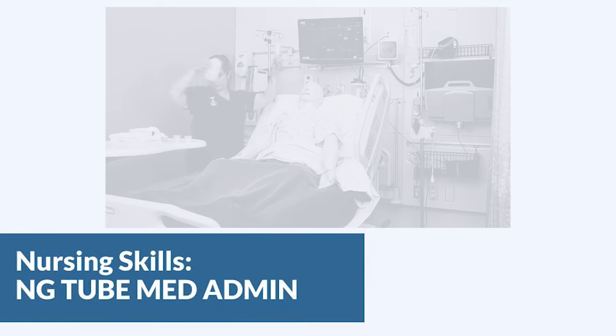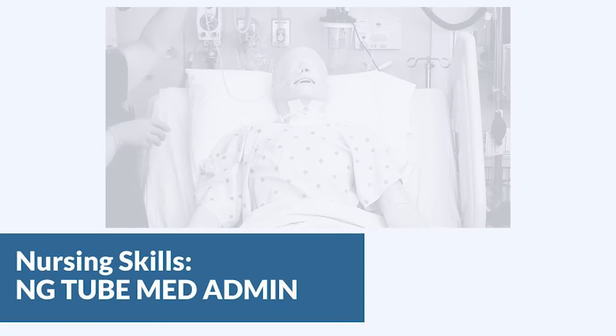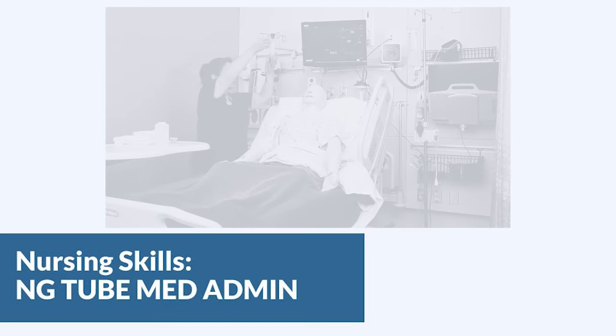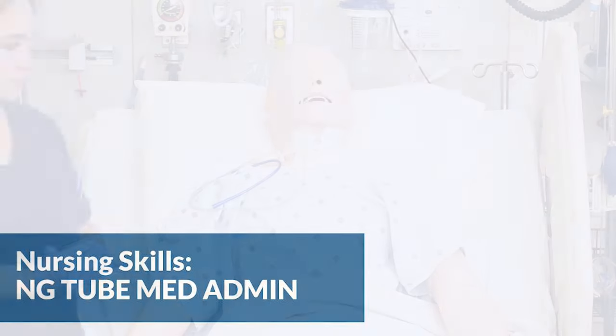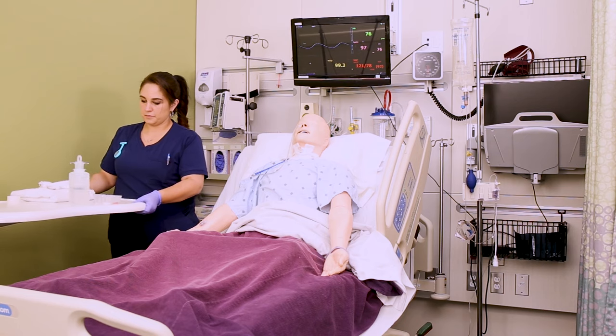In this video we're going to look at administering medications through an NG tube. There's a separate video for crushing the pills, so make sure you watch that one to know how to get these medications ready for administration. Also, never ever skip your five rights — make sure you're checking these meds against your MAR and your orders before you administer them. Now that we have the safety disclaimer out of the way, let's focus on the actual administration part.